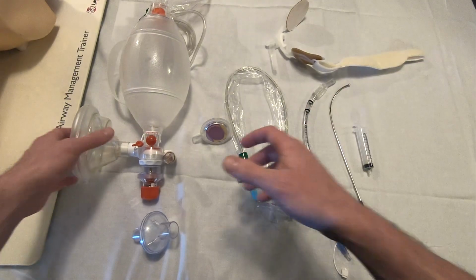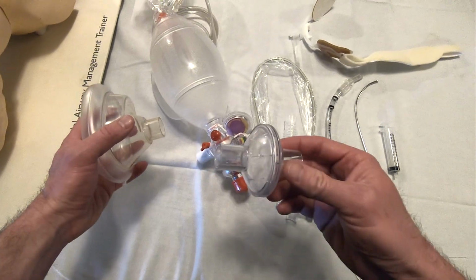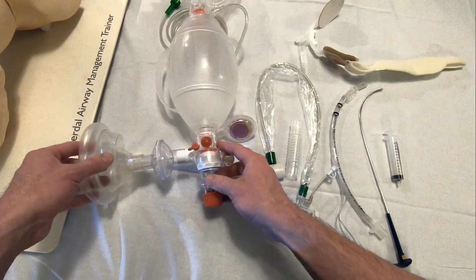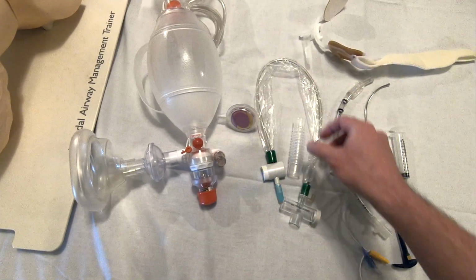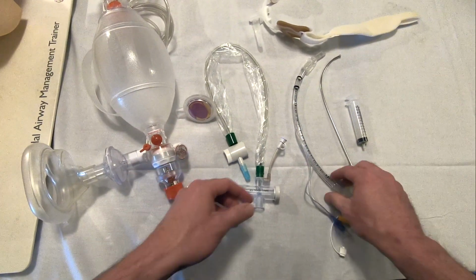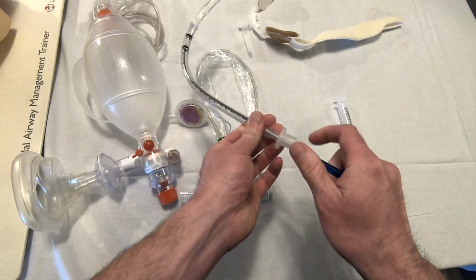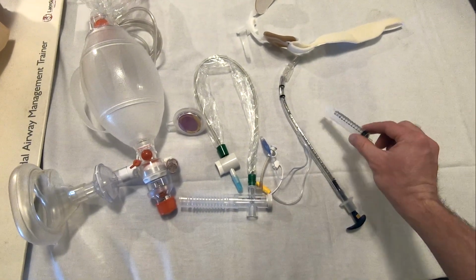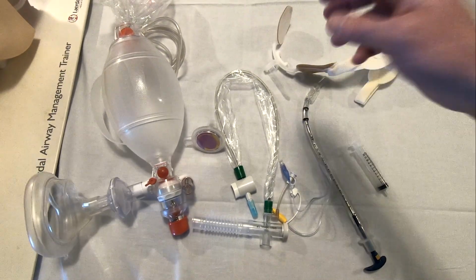First, we need to make sure our equipment is ready. A viral filter is inserted between the bag and mask. Then we need to make sure we have an end-tidal CO2 detector, ballard, ET tube with syringe and stylet in place, ET tube securing device, and video laryngoscope.